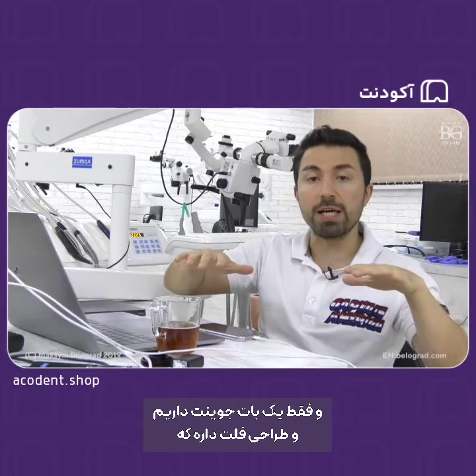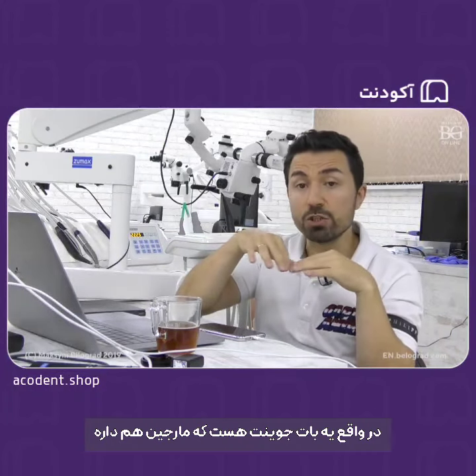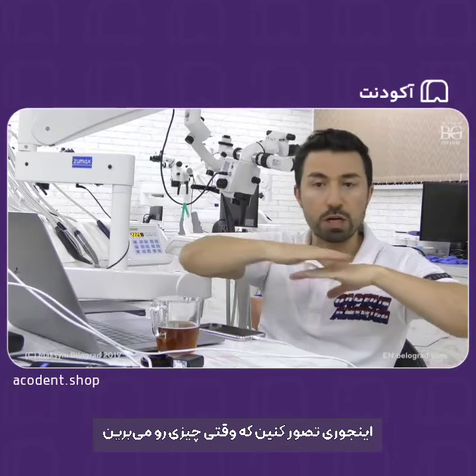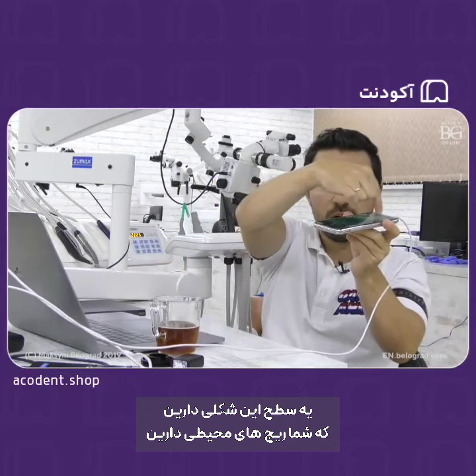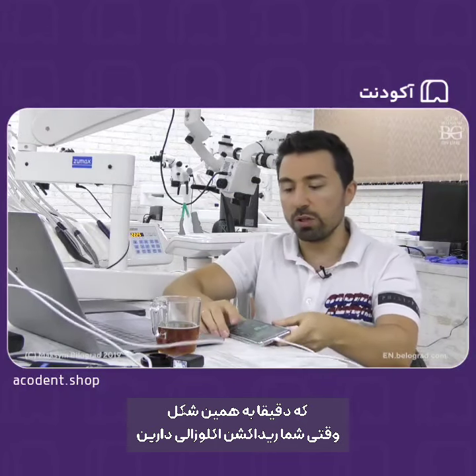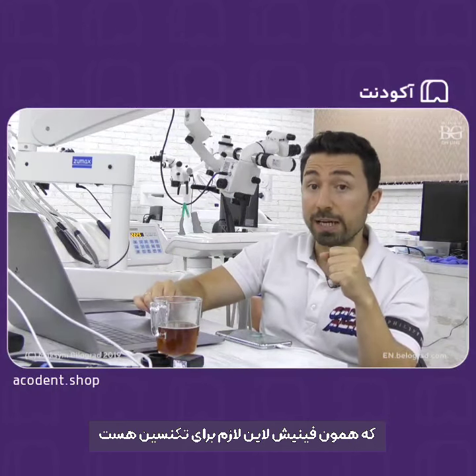It's a flat design following the anatomical curves, but it's just butt joint preparation. When you cut something, it's like a table. It's like this, okay, and you have a ridge, a peripheral ridge. So the same when you just do occlusal reduction, there is a peripheral ridge, which is the finish line for the dental technician.